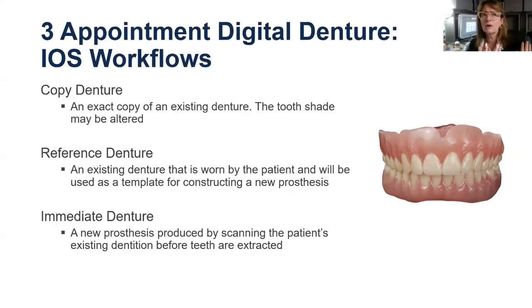Lots of success with the immediate denture, lots of success with the reference denture, lots of success with the copy denture. The fourth option would be the fully edentulous patient scan. And I'm going to get to that in just a little bit. It's not quite 3 appointments, in my opinion, because we should probably add in a base plate and bite block to assist you in verifying the bite.